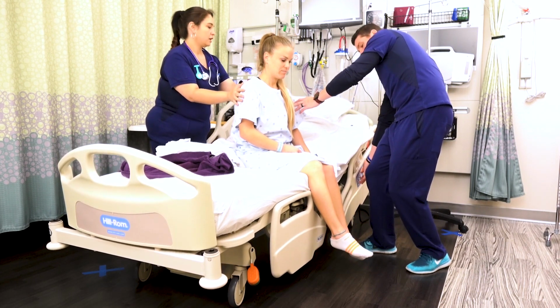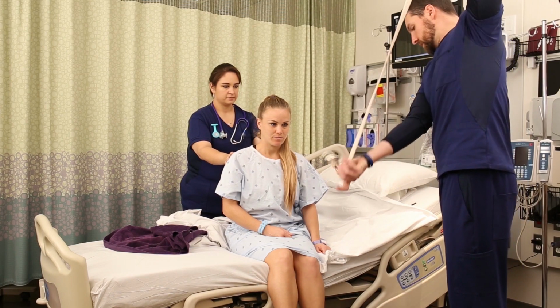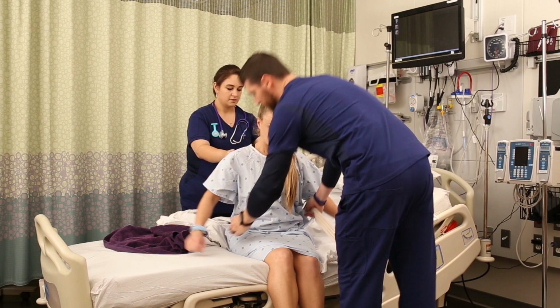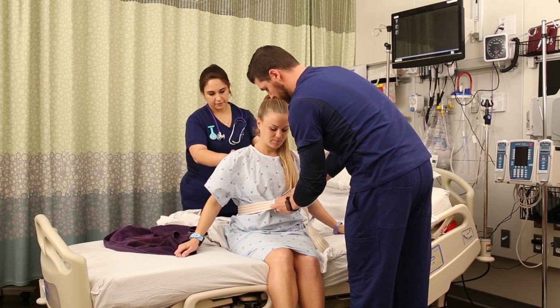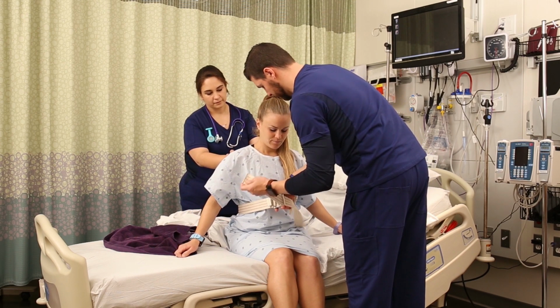Now at this point, if your patient might be a little unstable when they're standing, then you can go ahead and apply a gait belt for support. Remember, a gait belt should be placed just below the rib cage, tight enough to give you a firm grasp, but still loose enough to be able to reach your hand under and hold on to it.